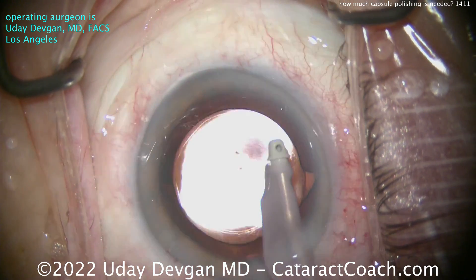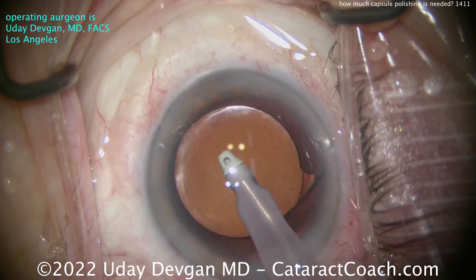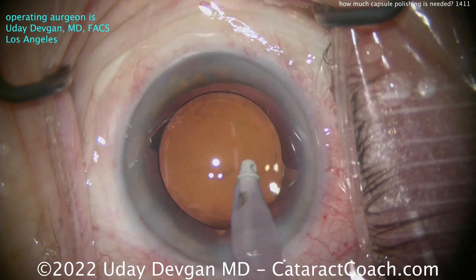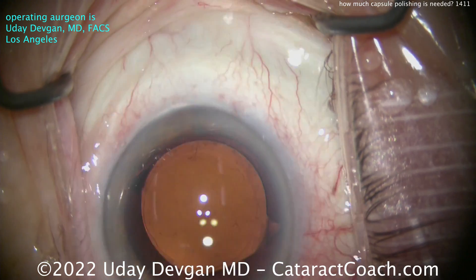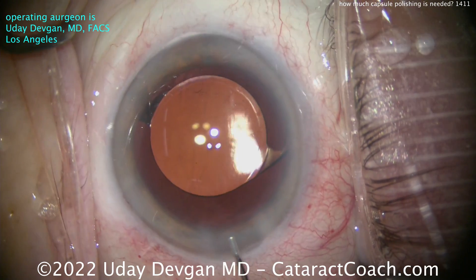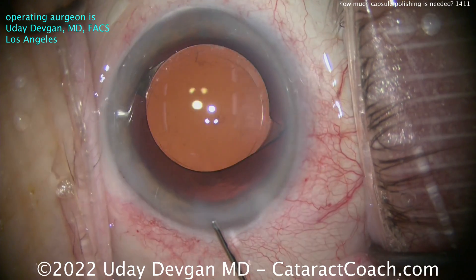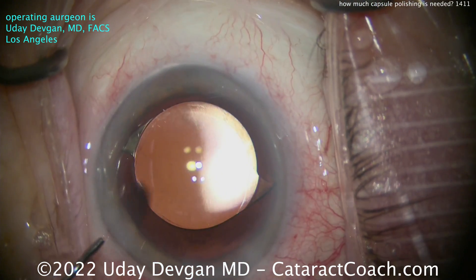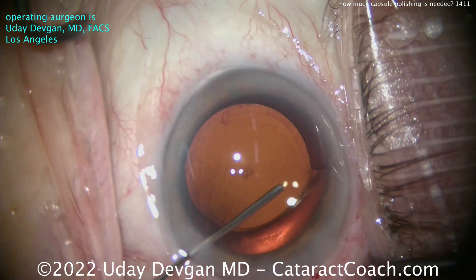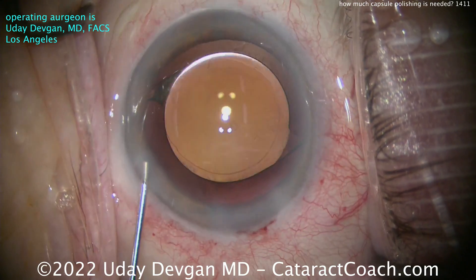Think about balancing it out. It's easy to be an armchair quarterback and say you would have done X, Y, and Z differently, but you can't always tell the whole story just by looking at the eye. This patient is 94 years old — I know it because I just did the surgery — and I want to be super cautious to give the patient a fantastic outcome. Look at that beautiful centration of the lens, that 360-degree overlap. I love that rhexis. Look at those Purkinje images beautifully centered in the center of that optic.